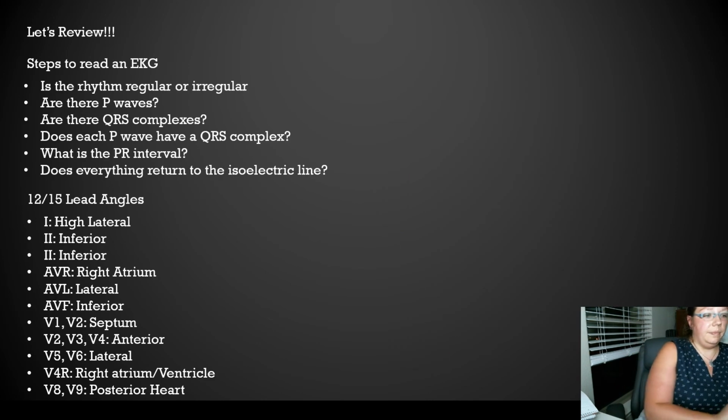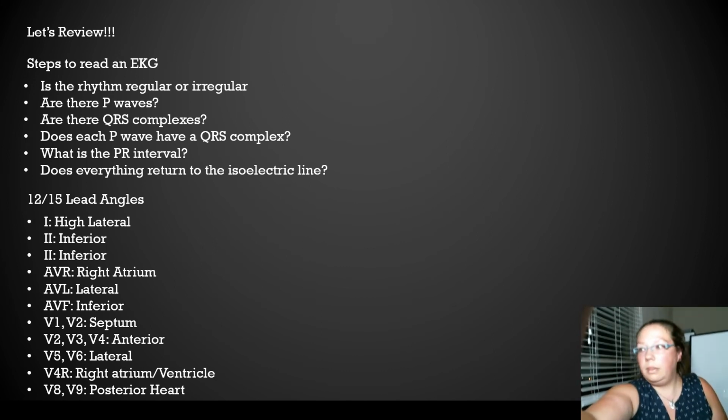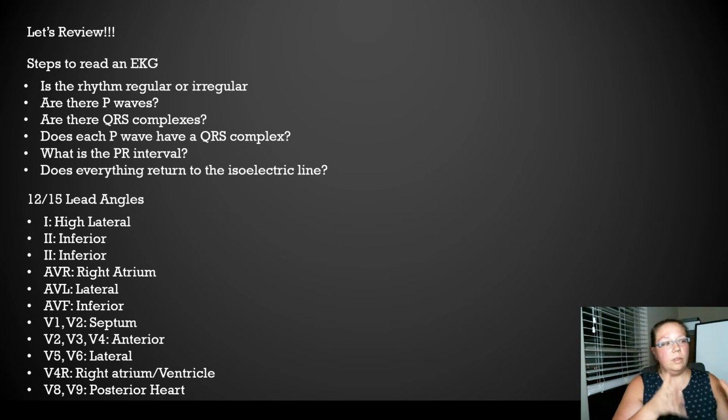So, sinus rhythms. Oh, I wanted to leave that up for you, sorry. Take a picture, make notes. But this is how you read an EKG and then what the 12 and 15 lead.